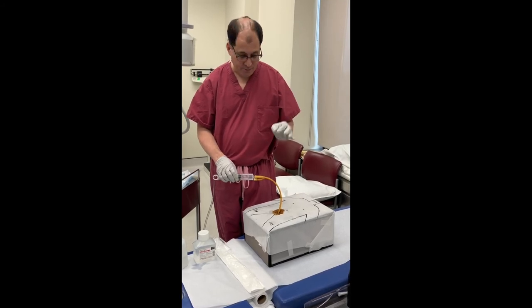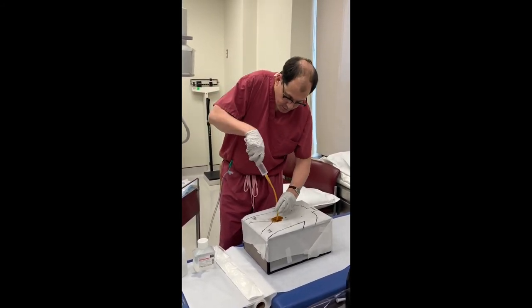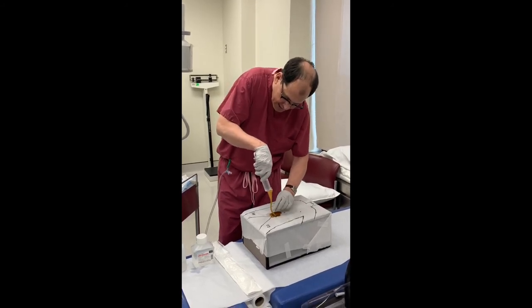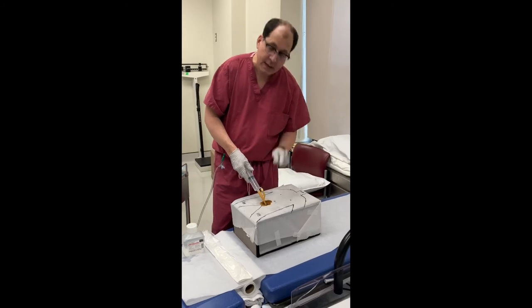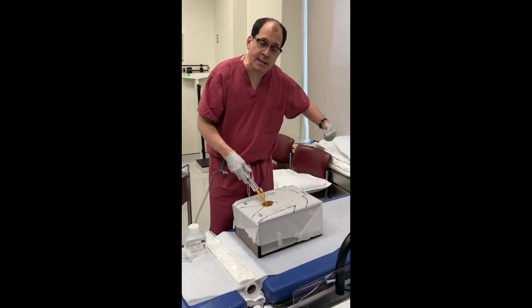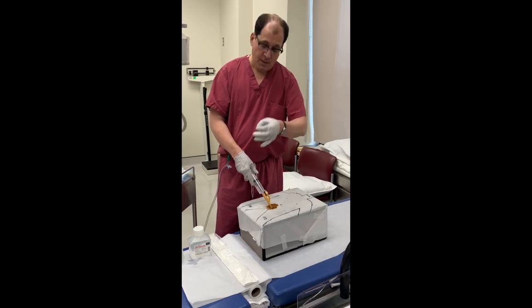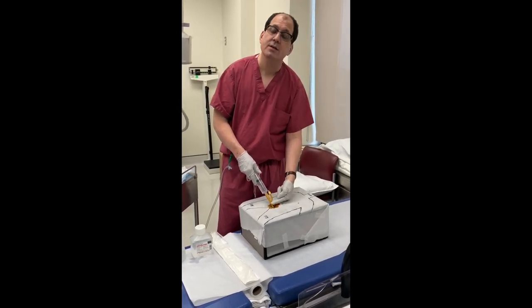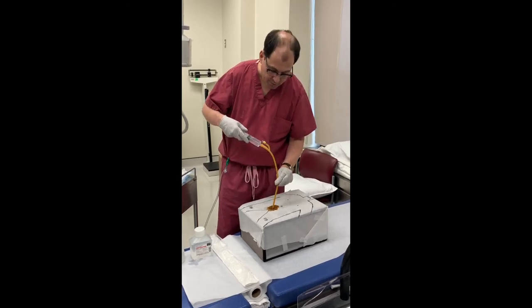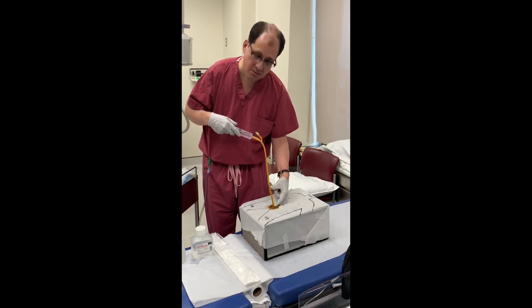So the keys are: one — when you put the catheter in, don't shove the whole thing in. This is a big mistake. If you push it in all the way up to the cup, in women it can pop out the urethra and end up outside of the body. In a man, you're more likely to shove it into the prostate. So all you have to do is really two or three inches — that's it, not even.